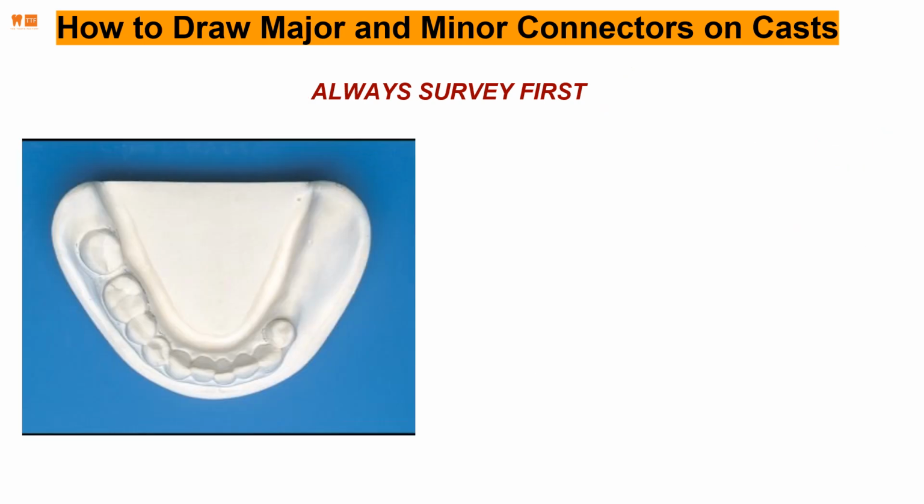So if I were to do the same on this diagram here for the lower, we would have this is, first of all, this is a class 2. No mods. Okay. So edentulous spot. Very, very basic. We will draw a denture base coming out like that and 45 degrees other way.